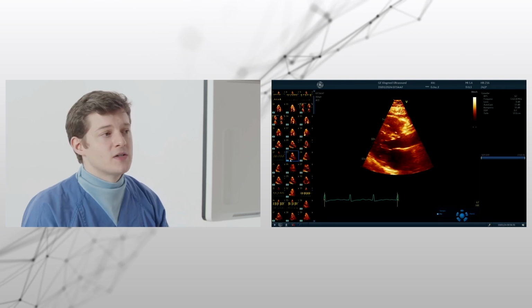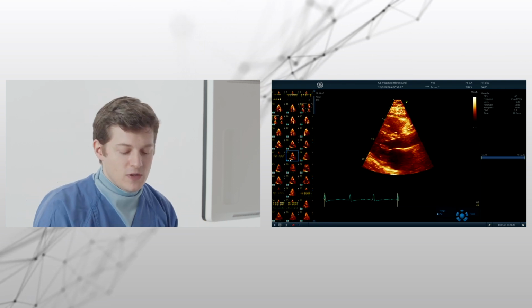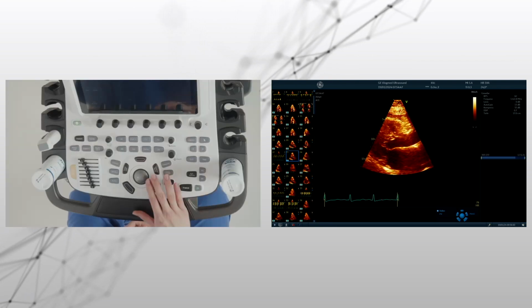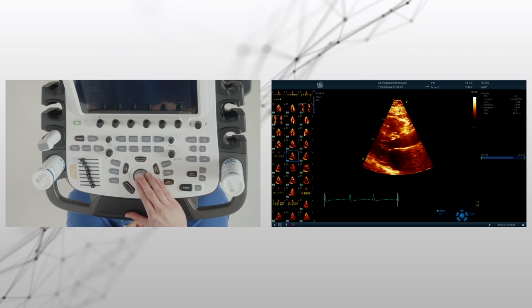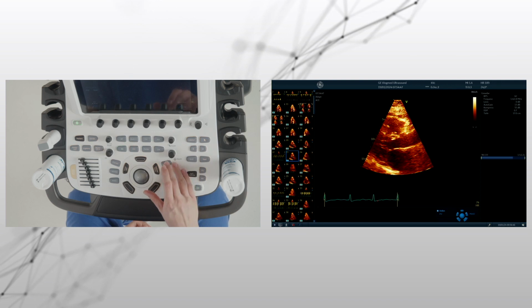Now, as we have finished our hands-on evaluation of the patient, we normally in our setting go offline and see the images and loops on a computer program. But we can also, of course, measure with the machine, and we start again with the parasternal long axis view. And what you can do is, all the time you have to stop your image, because then you actually can measure. And the first structures we want to see are the aortic structures.